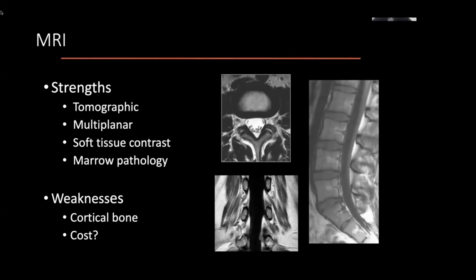I mean, you can obtain a CT scan in under a minute, whereas an MRI with multiple sequences will traditionally take at least 20 minutes, and typically a lot longer than that because of the various requirements and evaluations that are needed prior to performing the MRI. So it becomes a logistic and scheduling issue more than anything in the context of a hospital practice. And it's important to bear that in mind.